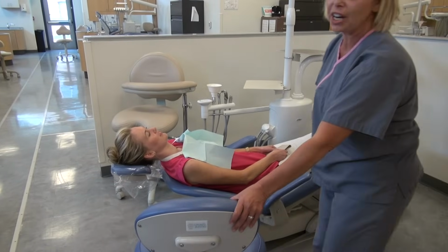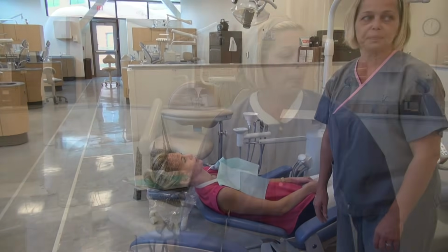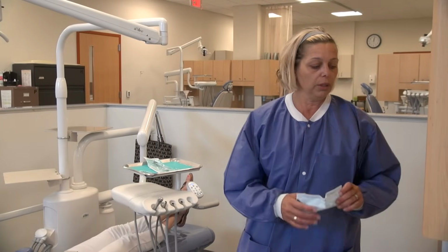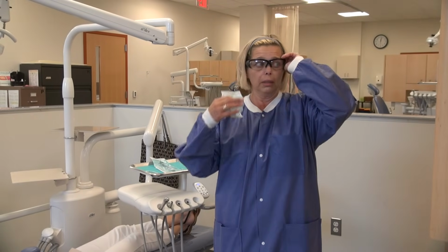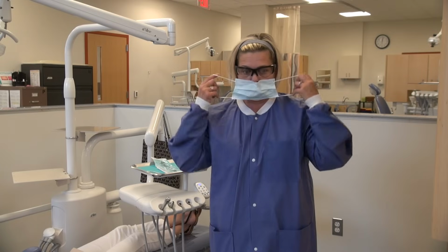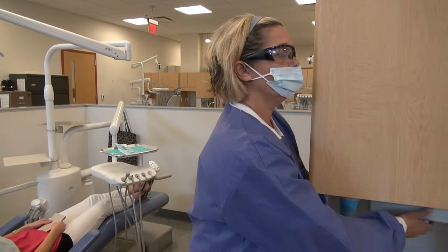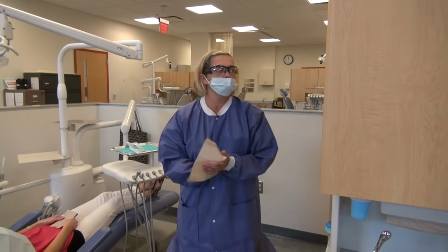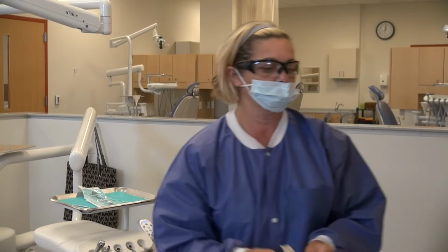Place the operator chair and the rheostat in the operator's position. Place your PPEs on, your mask and eyewear, and proceed to wash your hands. And now you can don your patient exam gloves.